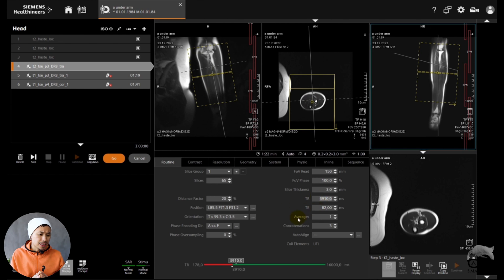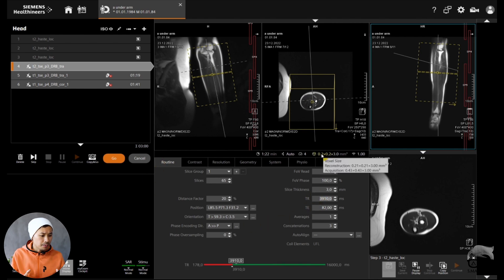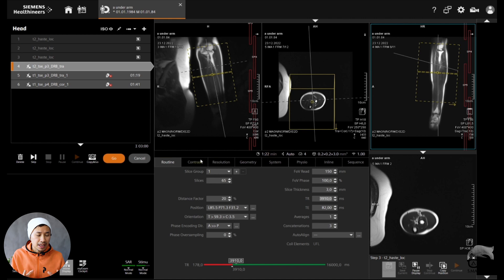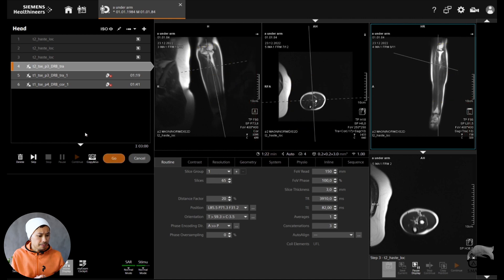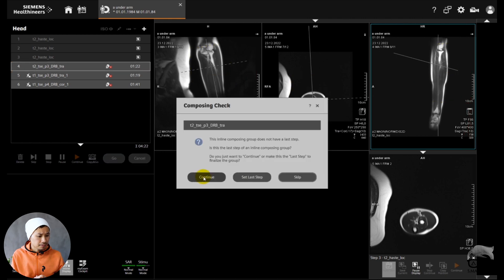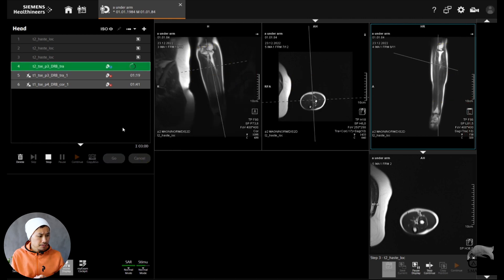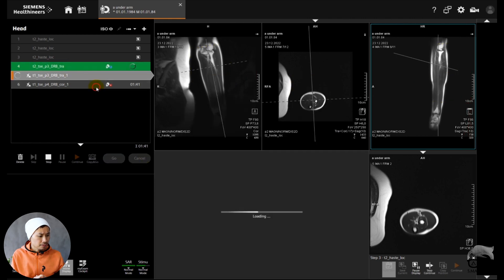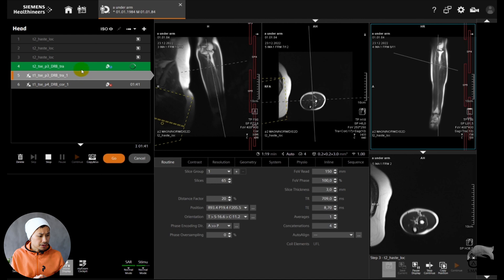Two transversal sequences — a T1 and a T2 — and one coronal T1. I'm going to position the transversal T2 here, and then do the same for the T1, just copying everything so it will be in the same position and same parameters.